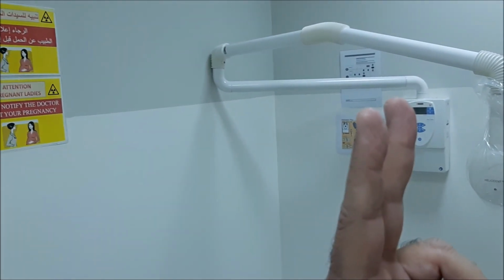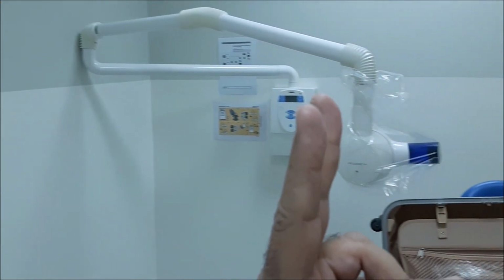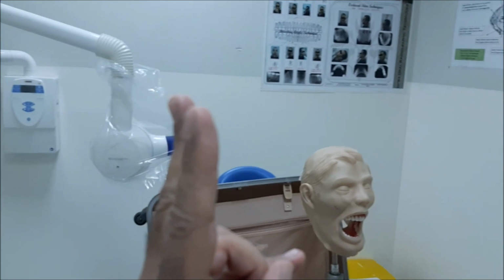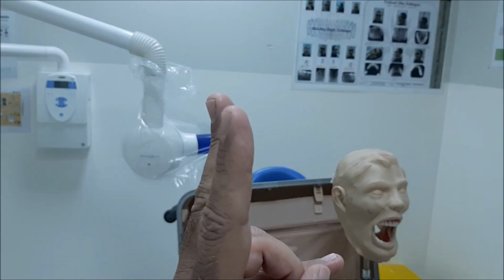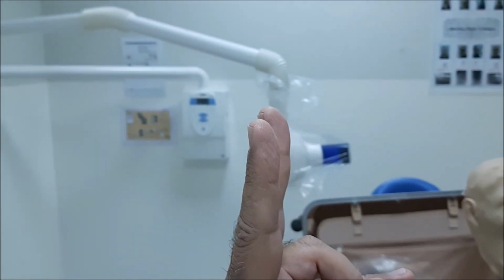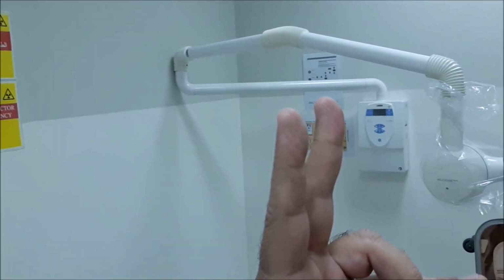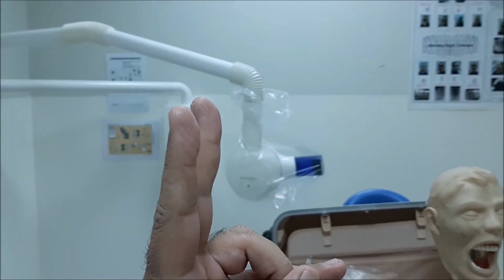You can see that this finger is just following the camera movement, while the buccal canal, in this case my index finger, is moving against my camera movement, right?